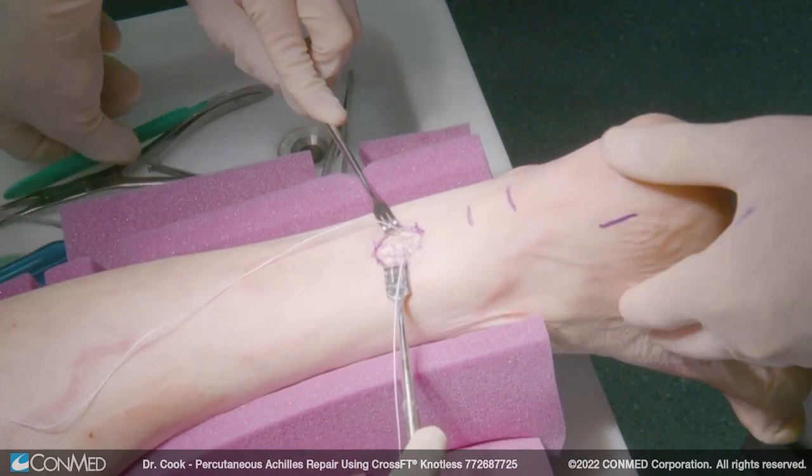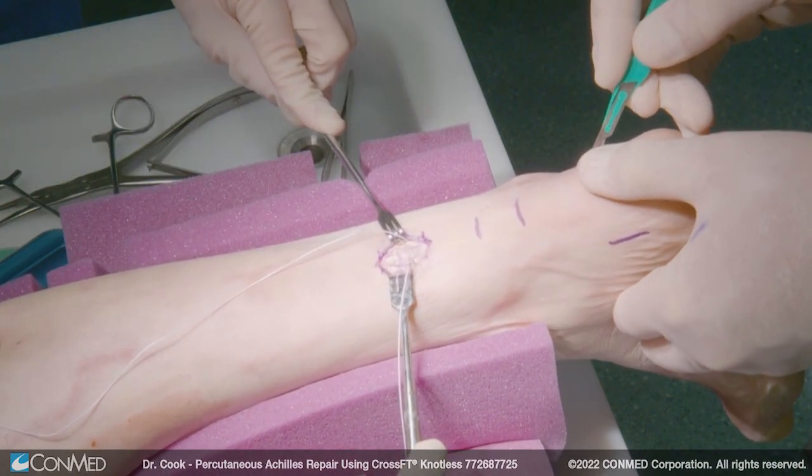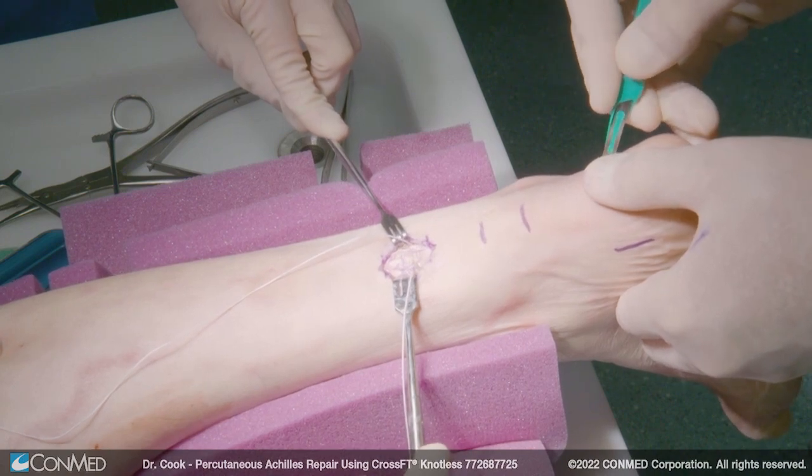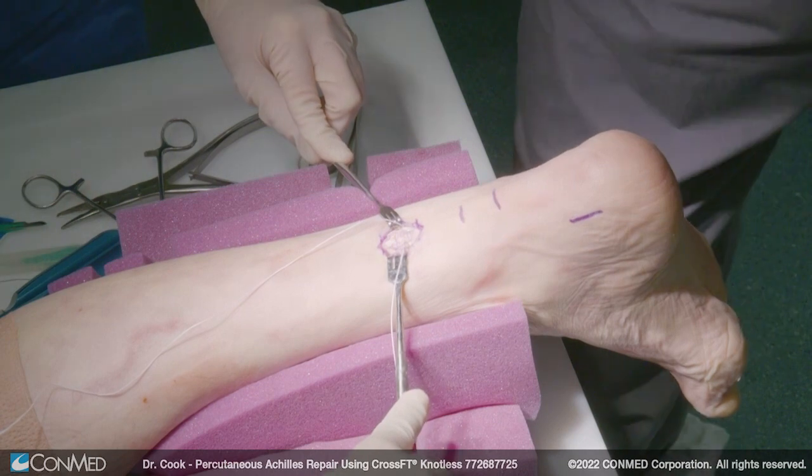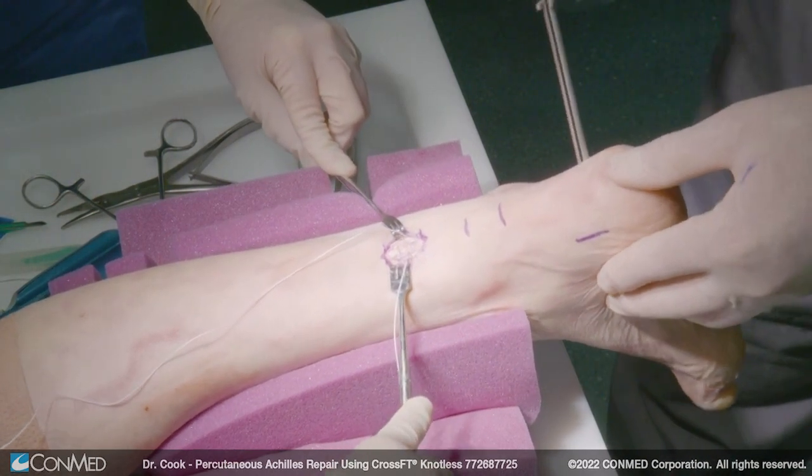We do not want to go through the tendon. We want to go just medial and lateral. If you go through the tendon, a lot of patients have pain.